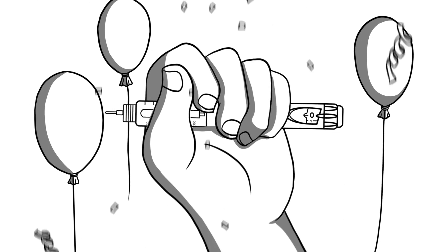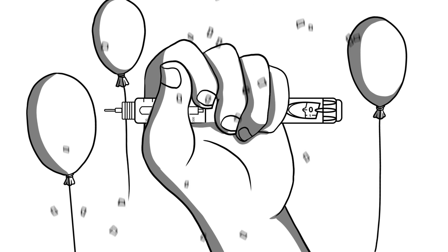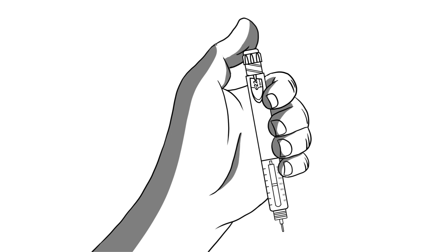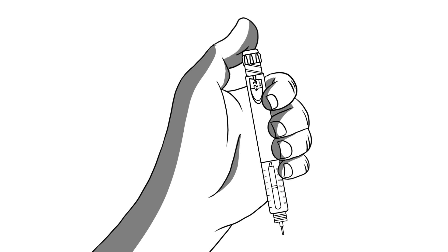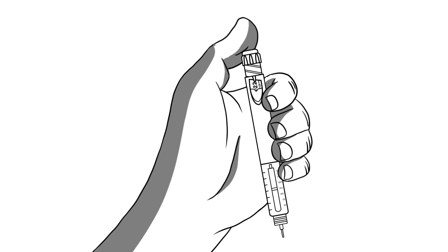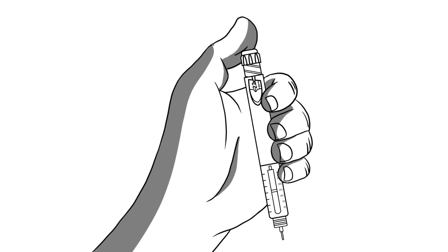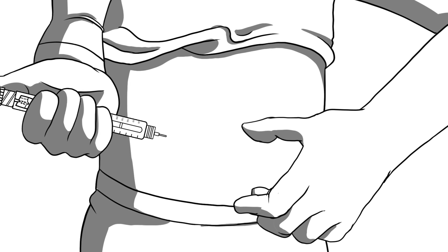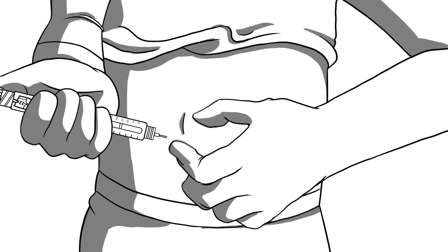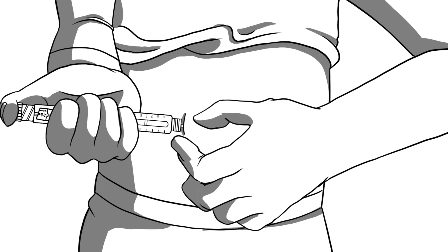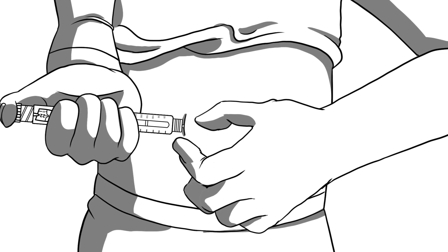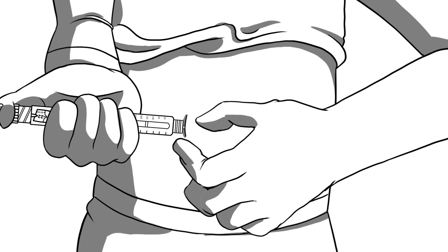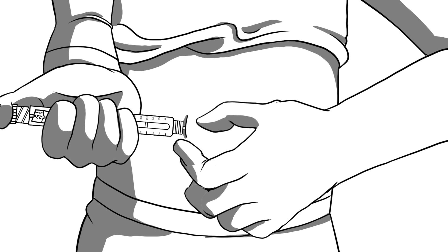Part 4 The Injection Party. Party Time. Let's celebrate all that preparation with an injection. Once you have dialed your dose, hold the pen like you would a retractable pen with your thumb over the button. After cleaning the skin with an alcohol pad, insert the needle directly into the skin at a 90 degree angle. Some people may feel more comfortable pinching the skin around the injection site, but this is not necessary for a successful shot.